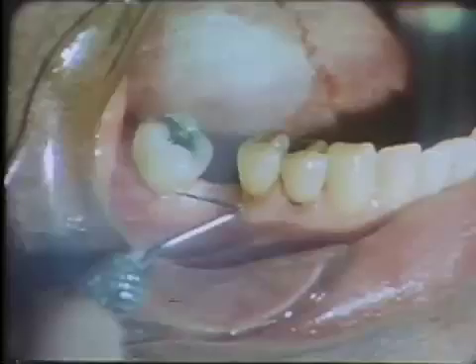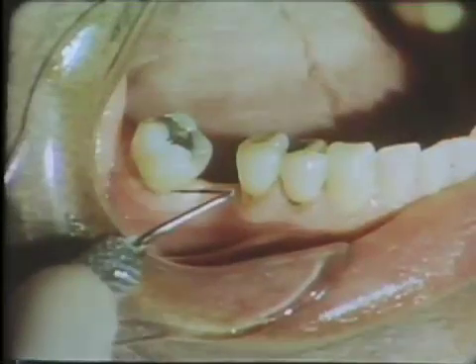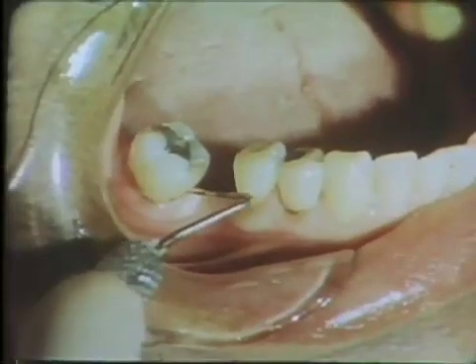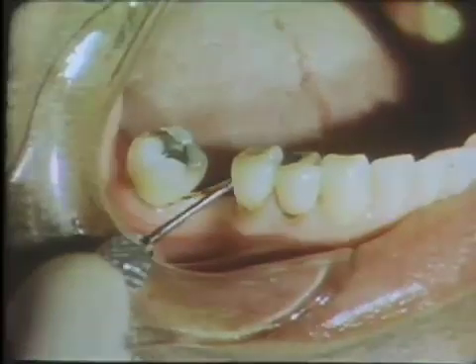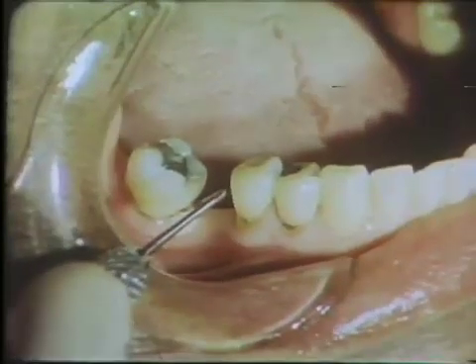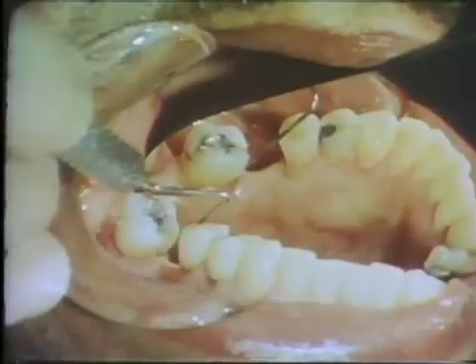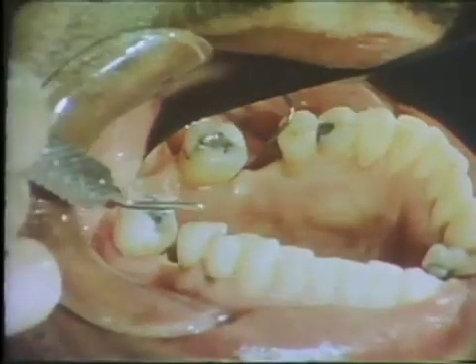A radiograph of the right mandibular third molar shows that an angular bone defect is present on the mesial aspect. Notice the loss of the first and second molars. Probing indicates mesial pockets which are 5 to 6 millimeters in depth. The mesial lingual pocket measures 6 millimeters.